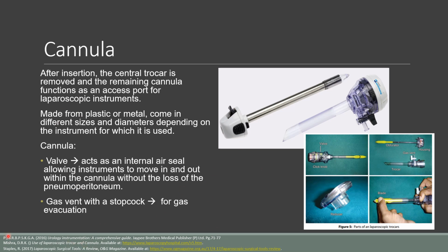And then the second important part of the cannula is the gas vent with the stopcock, and this is basically for gas evacuation, for if we're using any type of diathermy during the procedure.